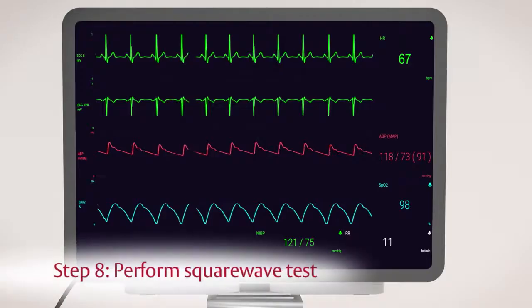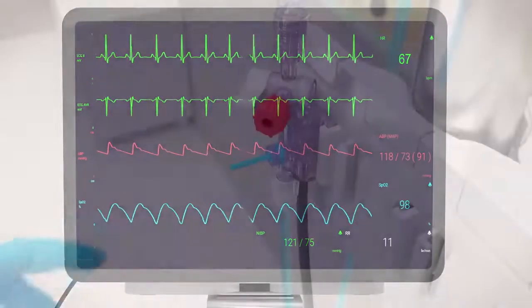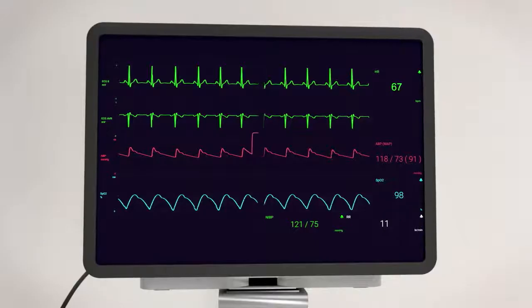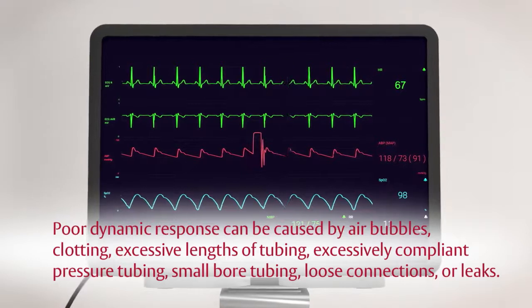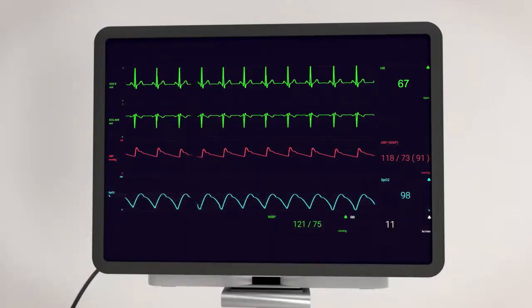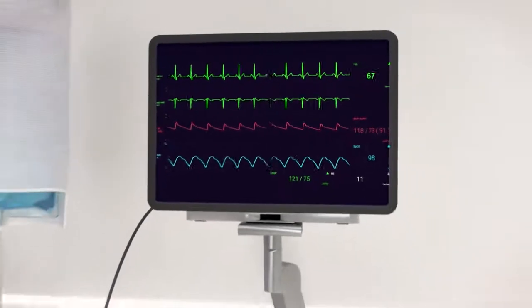Step 8. Perform a square wave test to assess the frequency response of the system by pulling the snap tab and releasing quickly. Please be advised that poor dynamic response can be caused by air bubbles, clotting, excessive lengths of tubing, excessively compliant pressure tubing, small bore tubing, loose connections, or leaks. Confirm the pressure channel has the appropriate label, scale, alarm settings, and color coding for the physiologic pressure being measured.